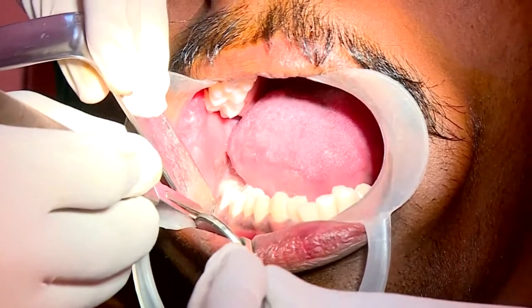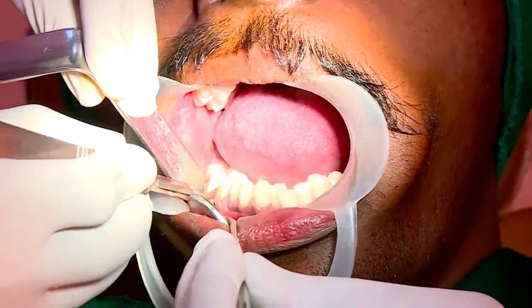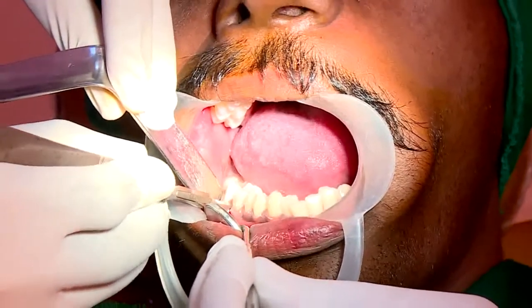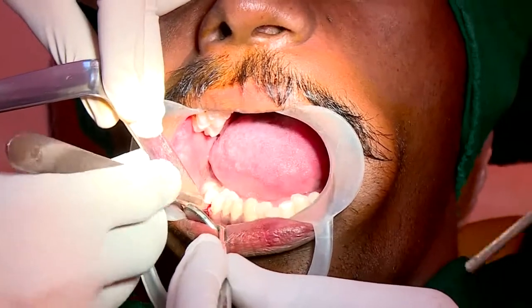So, it should be towards you. While making the incision, it should be towards you. Also, hold the handle in a pen grasp or a modified pen grasp.